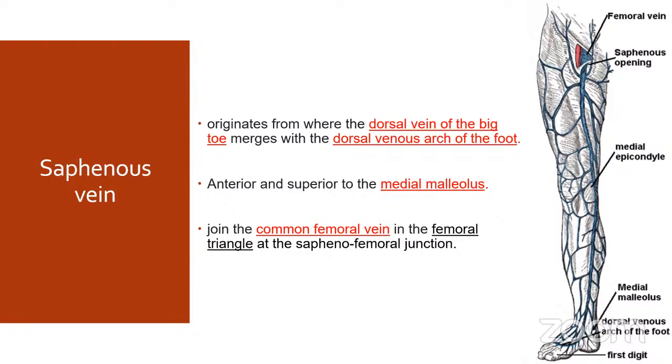Okay, this is not science. So it's personal preference. I must say, occasionally we have gone with the dissection all the way to the foot. If you have a very good distal vein, you can go even beyond the malleolus and into the foot itself. So yes, you can do things. You do whatever you think is best for your patient.